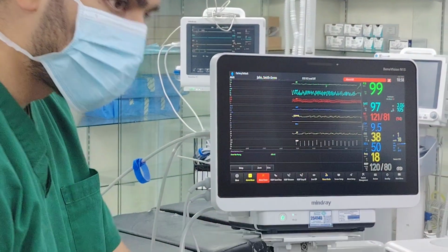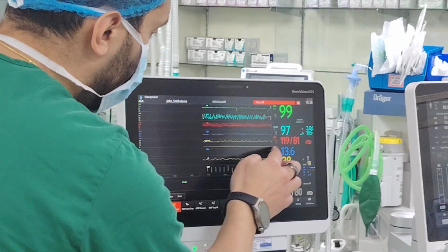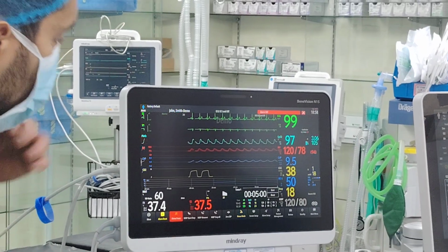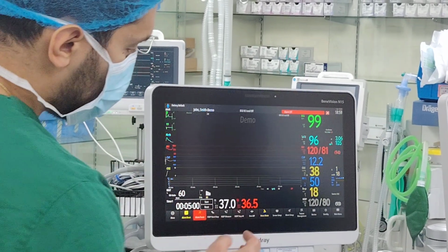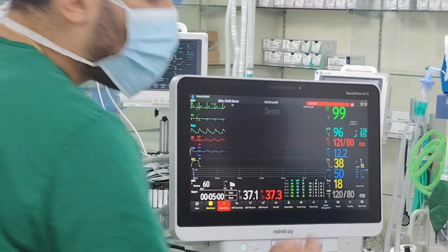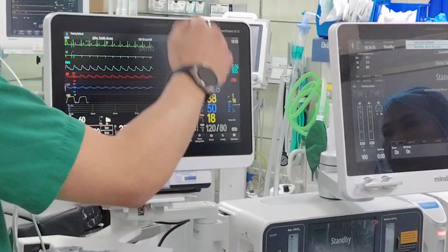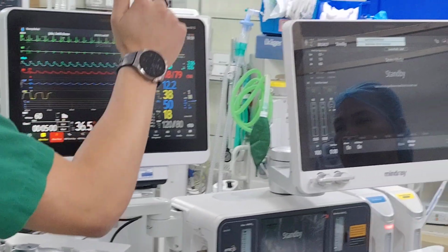You play around with it, explore with this is some few things. Now, we will go to the arterial line and CVP, okay? Arterial line, the most important thing is you have to do zeroing. CVP, you cannot get a measurement before it does zeroing for you. It will tell you zeroing required, and I think arterial line also, if I'm not mistaken.